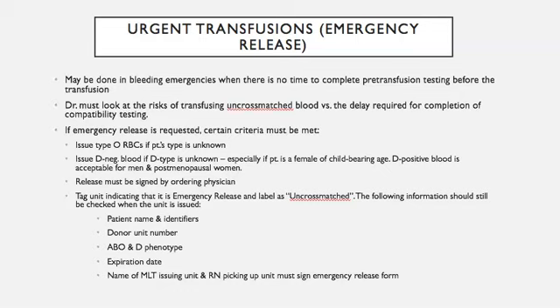On the bench, you could probably get an ABO-RH antibody screen done in 20 to 30 minutes. It might be closer to 45 minutes if you're doing it automated. So the doctor just has to take into consideration how long it is going to take to get blood for this patient who is in the midst of a bleeding emergency.